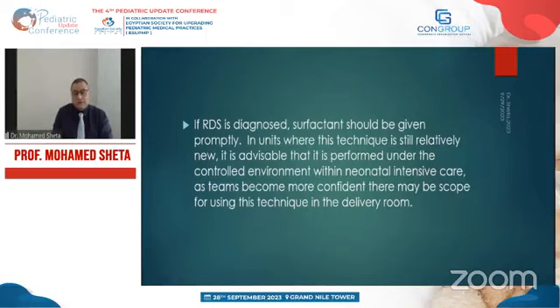In units where this technique is still relatively new, it's advisable that it's performed under a controlled environment within the neonatal intensive care. As teams become more confident, there may be scope for using the technique in the delivery room.